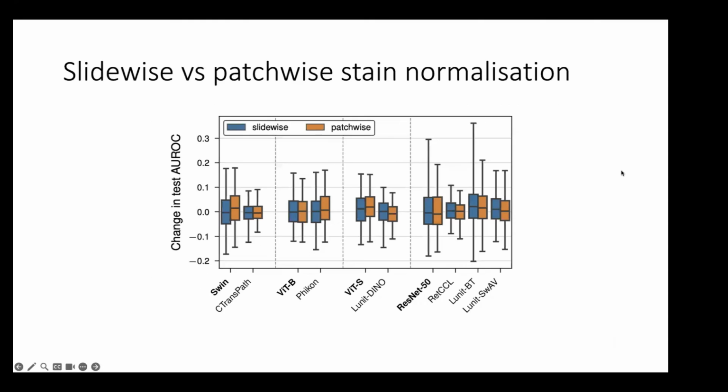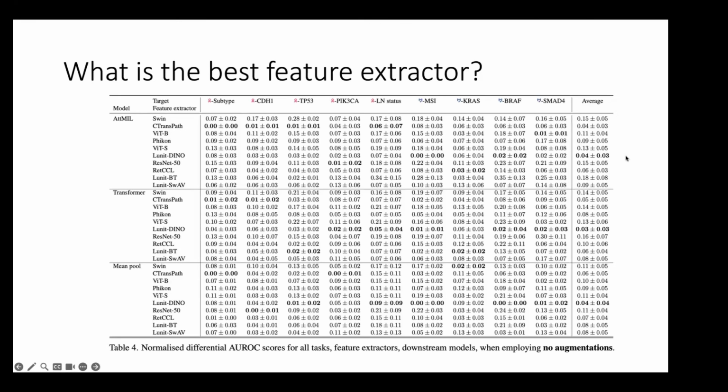Maybe you can correct for that to make sure that the improvement is due to the feature extractor itself and not the tissue type the feature extractor was trained on. Because then the subsequent question is, let's say I have the power, right? Should I just retrain on my own tissue, or eventually the weights that I can find online would be better? I think that's the most interesting question.